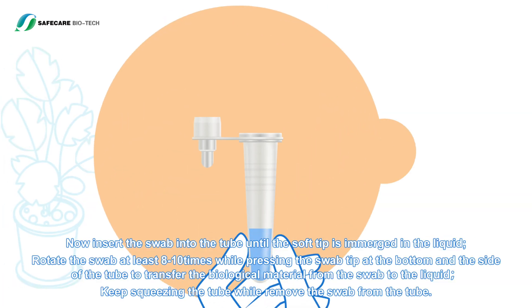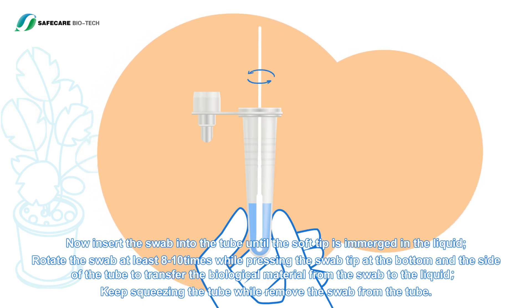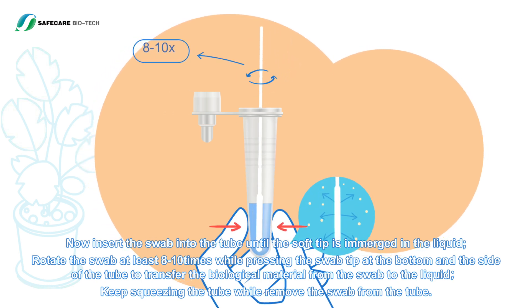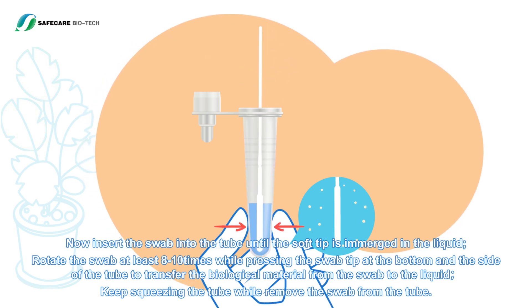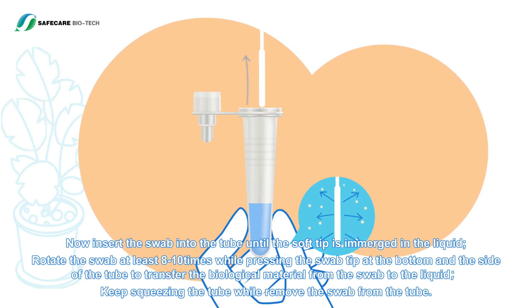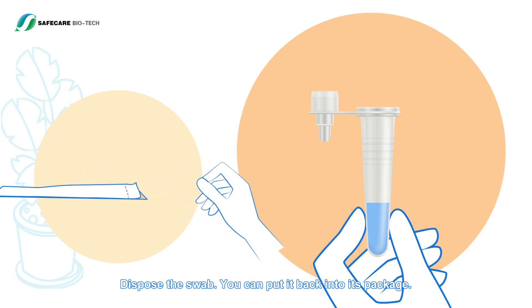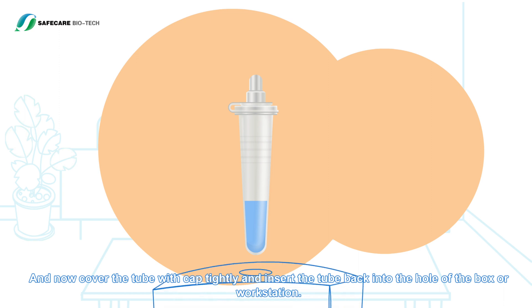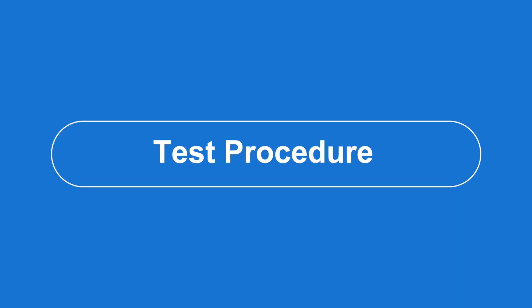Insert the swab into the tube until the soft tip is submerged in the liquid. Rotate the swab at least 8 to 10 times while pressing the swab tip at the bottom and sides of the tube to transfer the biological material to the liquid. Keep squeezing the tube while removing the swab. Dispose of the swab — you can put it back into its package. Cover the tube tightly with the cap and insert the tube back into the hole of the box or workstation.